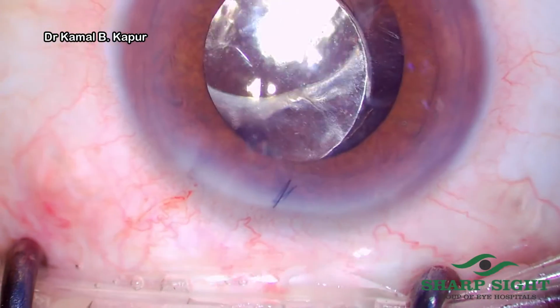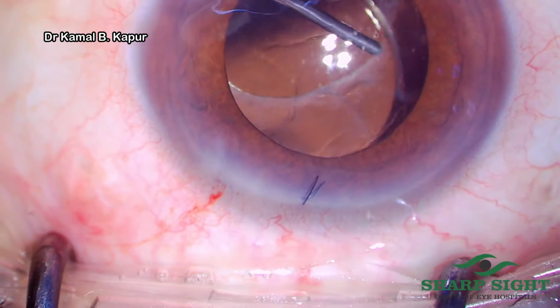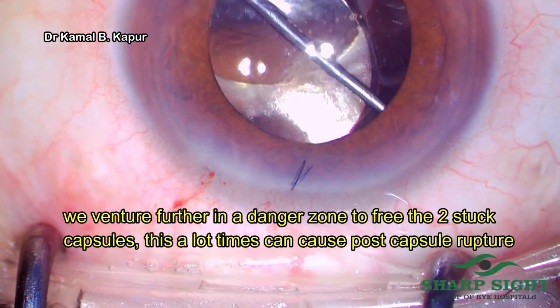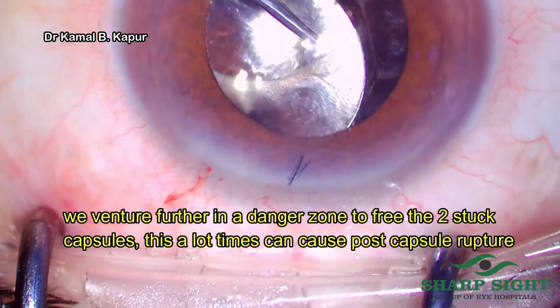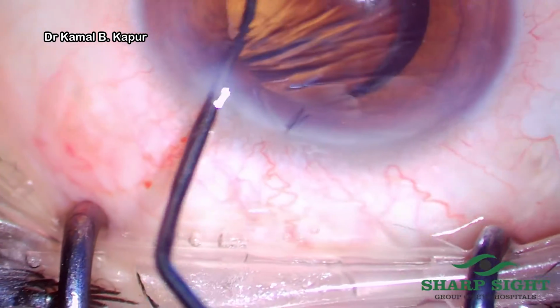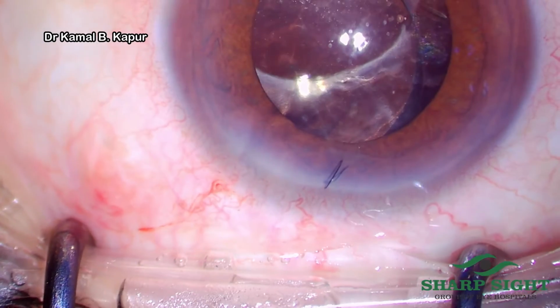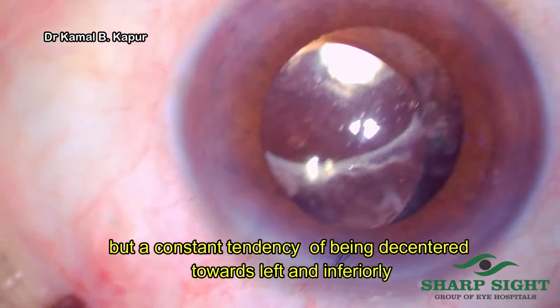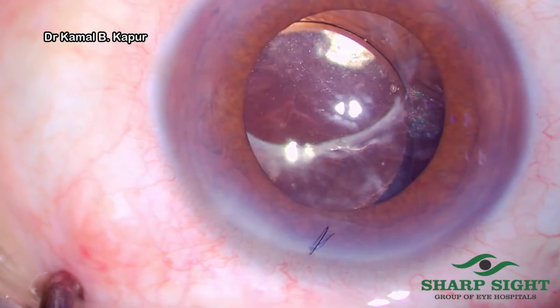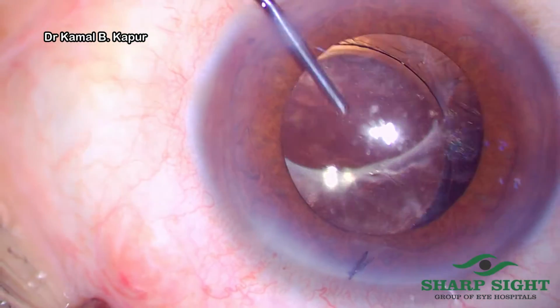Though we notice that it is slightly better positioned than what we started with. Now we actually venture out a little deeper. Now this is a very tricky situation because we are actually working in that area which is not very visible to us. We again are able to achieve slightly more movement because we have separated the anterior and the posterior capsular adhesions in that area where the IOL is not there. The anterior and posterior capsule have got stuck together and fibrosed. This is one big reason why the IOL will not go back into its original position.